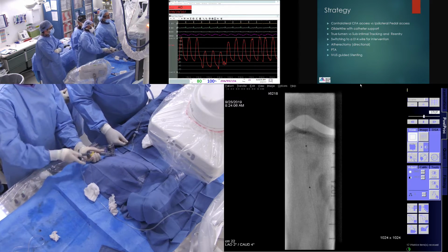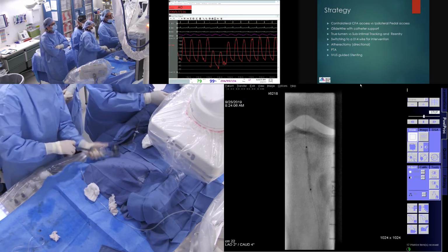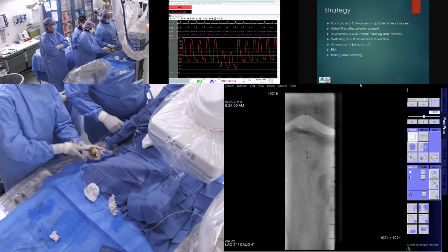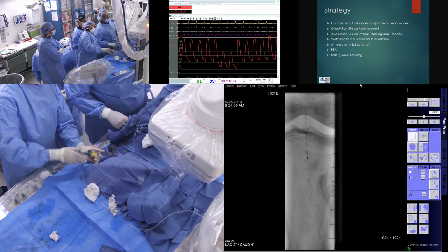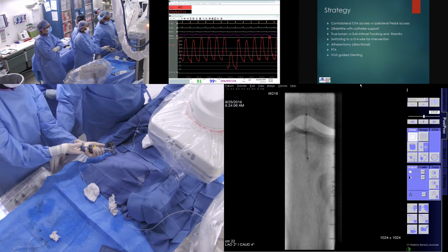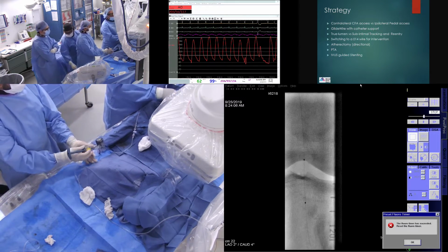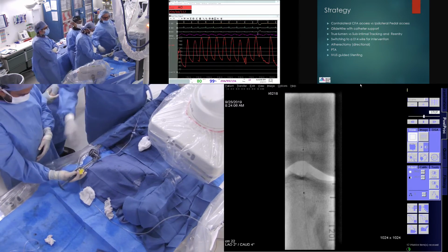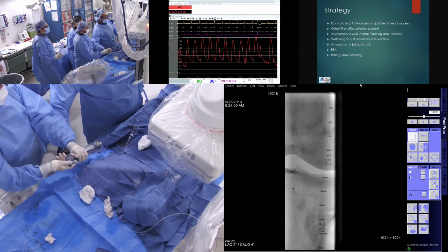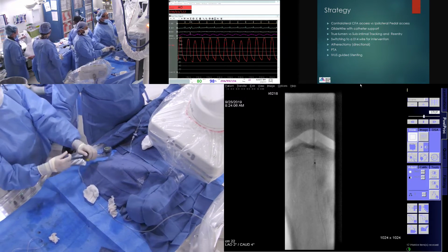As you know, with perforations, people are concerned with bivalirudin. But from the coronary literature, if you have a wire perforation with bivalirudin, especially in the heart, the chances of having tamponade are very, very low. We just turn it off and watch the patient, and it generally does not produce tamponade. In our experience, we're actually going to publish that bivalirudin is extremely safe in the peripherals, even with perforations. As long as you don't have a balloon perforation, wire perforations down there are not an issue.